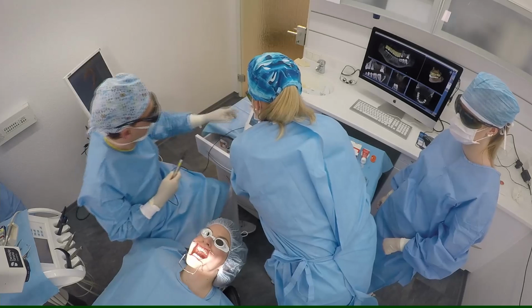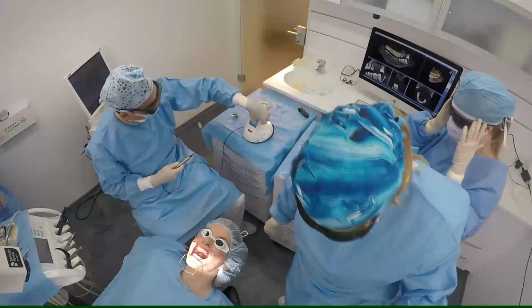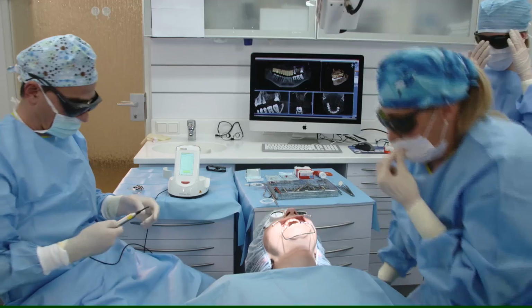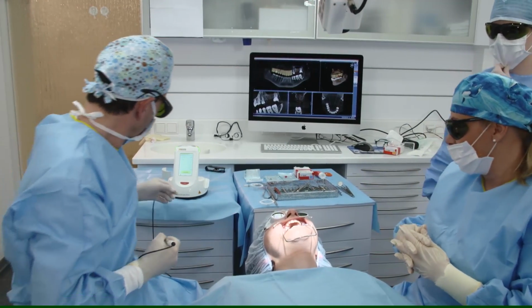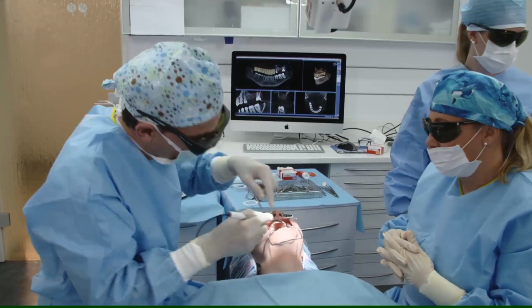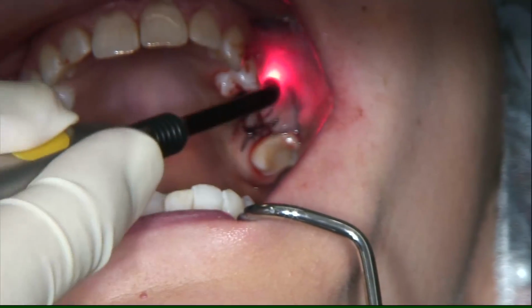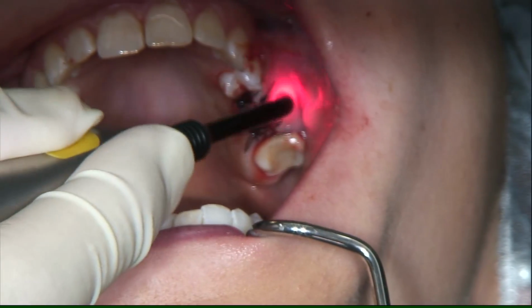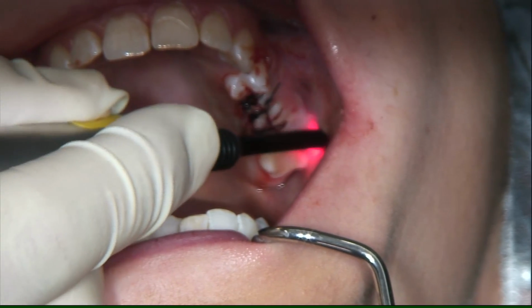But now we are using the soft laser treatment, and it is 660 nanometer. In contrast to the blue diode, which has 2 watt, this is 25 milliwatt, so less powerful.